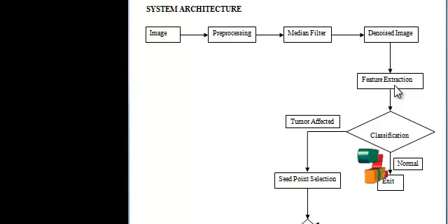A co-occurrence matrix, also referred to as a co-occurrence distribution, is defined over an image to be the distribution of the co-occurring values at the given offset. It represents the distance and the angular spatial relationship over an image subregion of the specific size. The GLCM is created from a grayscale image. The GLCM calculates how often a pixel with a gray level value occurs horizontally, vertically, or diagonally to adjacent pixels with the given value.